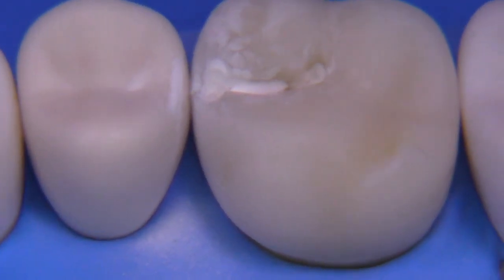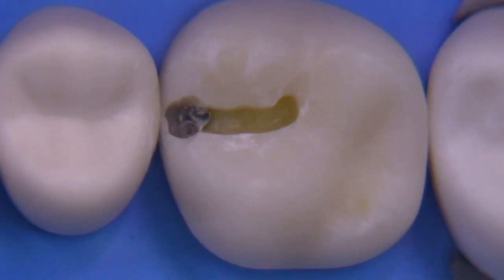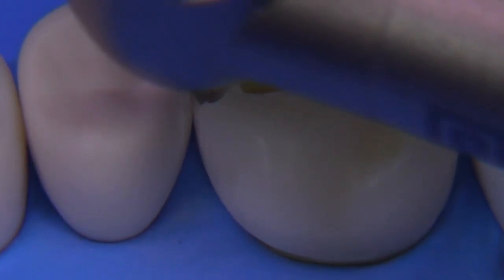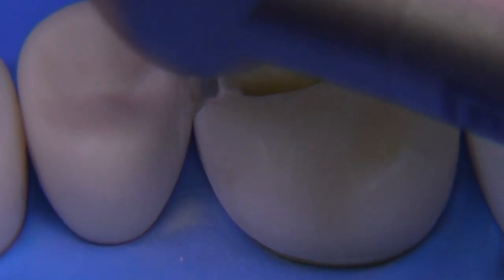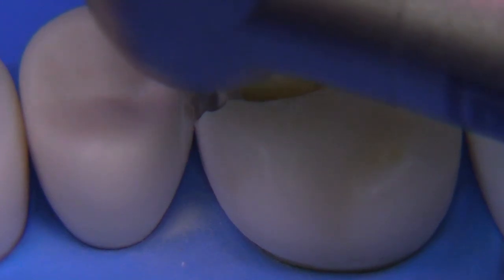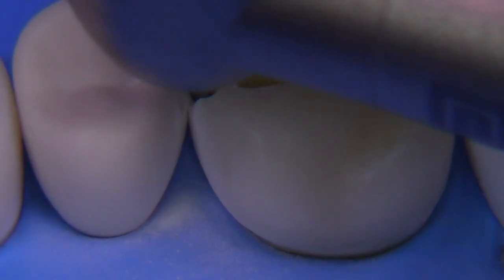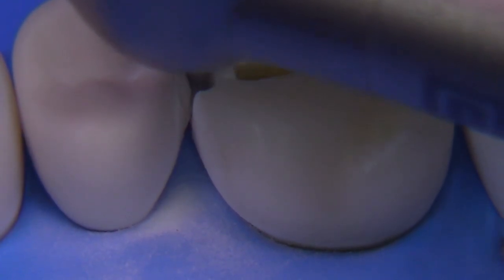We're going to continue now by dropping the box with the 245. You have plenty of room so you don't have to move the bur too close to the premolar. The enamel substitute material they're using is somewhat brittle like enamel and it's quite a bit harder, which is really good. Essentially what I'm doing is deepening the axial and refining the internal line angles as best I can with the 245 — always trying to seek that gingival clearance. That's the critical part about the box: avoid the adjacent tooth and seek gingival clearance.